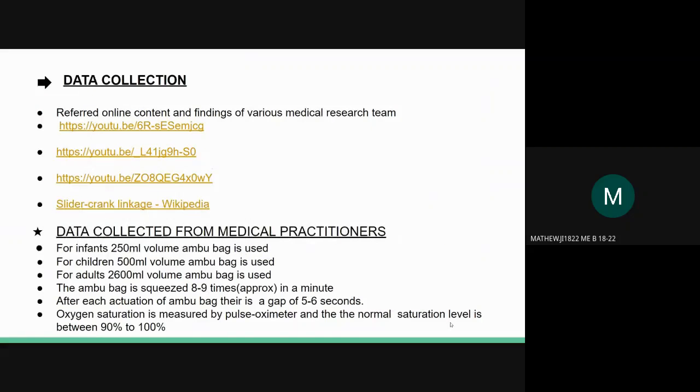Data collection. The slide shows the various media through which we have collected data. Because we are making such a sensitive device, we made the effort to also collect data from medical practitioners. We got to know that three types of Ambu are usually employed for patients according to their age group.